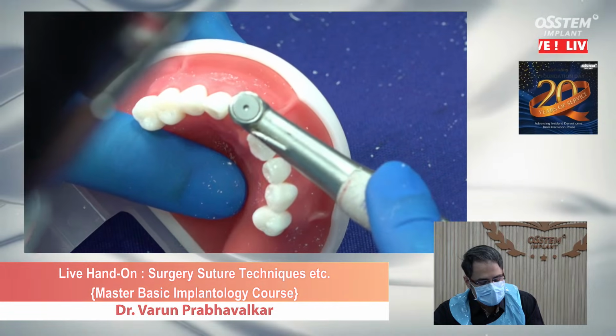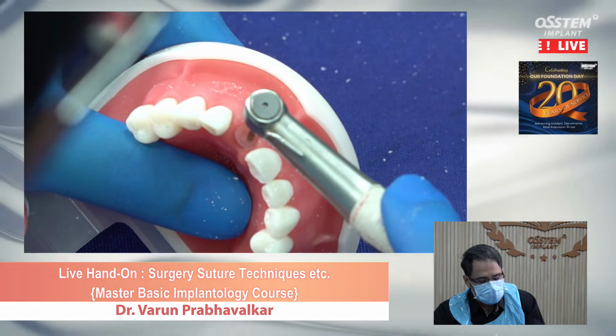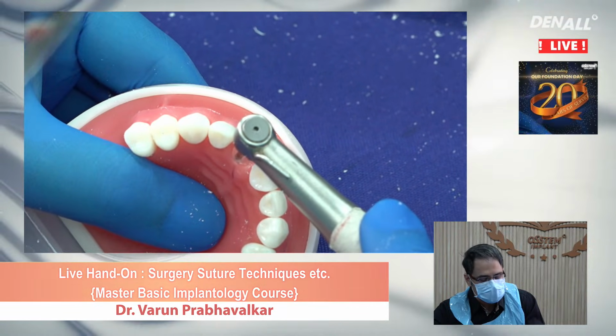Alright. I'm going to engage the palatal wall, and for that I go a little cross, and then I straighten my drill like this, and I go deep.